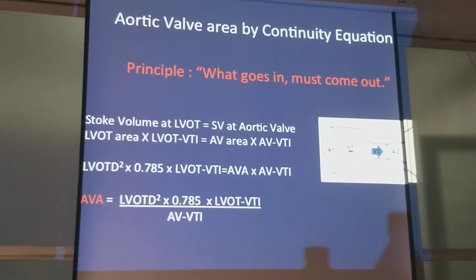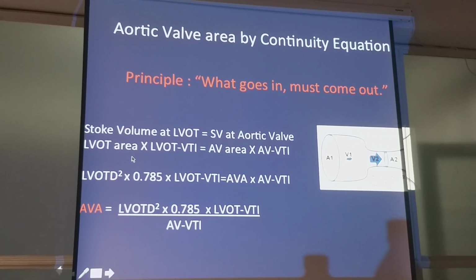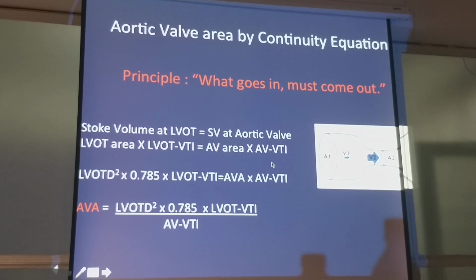এগুলো পড়েছো তো তোমরা হেমোডাইনামিক্সে পড়েছো? হ্যাঁ পড়েছো। আর এখানে স্ট্রোক ভলিউম অ্যাক্রস aortic valve area into aortic valve VTI.